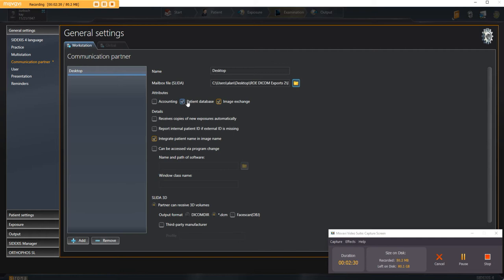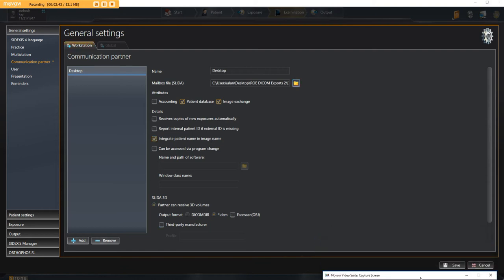You click patient database, you click image exchange which turns on this part down here, then you click on integrate patient name and image name, and then you click on the bottom right corner, save.